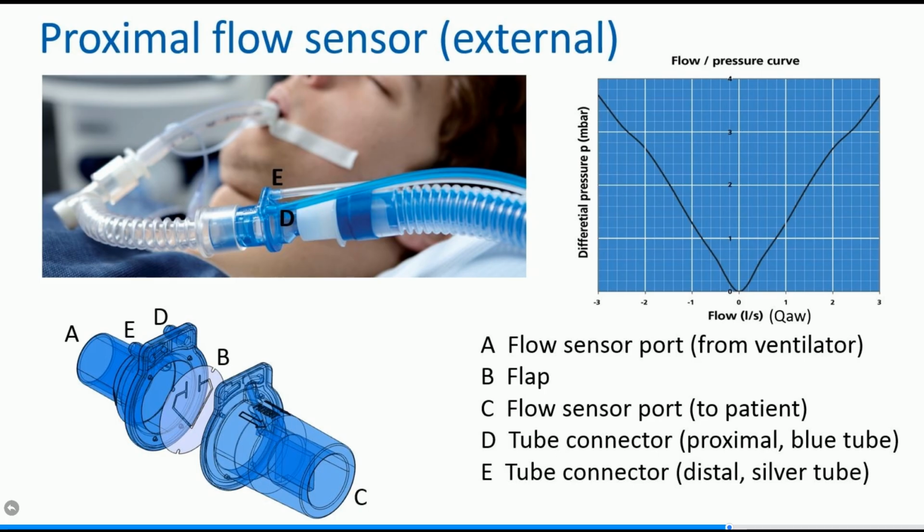The pressure difference is measured by a high-precision differential pressure sensor, the P flow sensor, located on the pressure sensor assembly inside the ventilator. The pressure difference varies with flow. The pressure-flow relationship is determined during flow sensor calibration so that the patient's flow can be determined from the pressure drop. The Hamilton T1 calculates volume from the flow measurements.